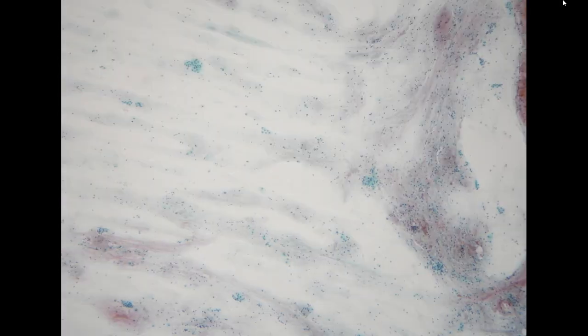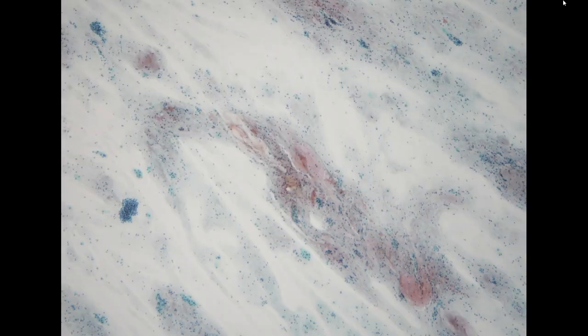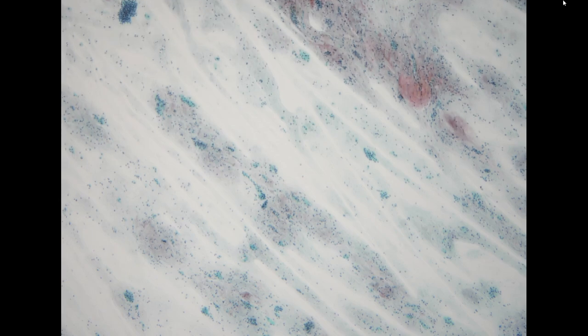So lastly, a pap smear from a 74-year-old female. The female had the clinical presentation of vaginal spotting for 1 month. She is 74, which means it is unlikely she still has menstruation. So it is a postmenopausal setting with postmenopausal bleeding.